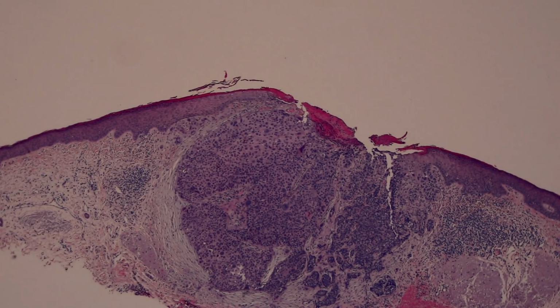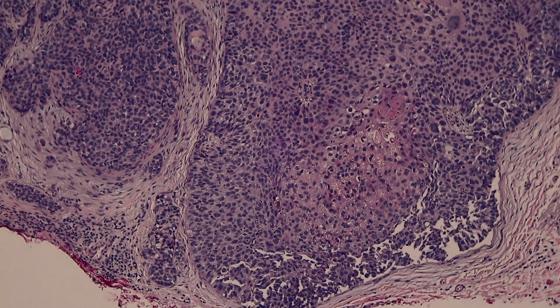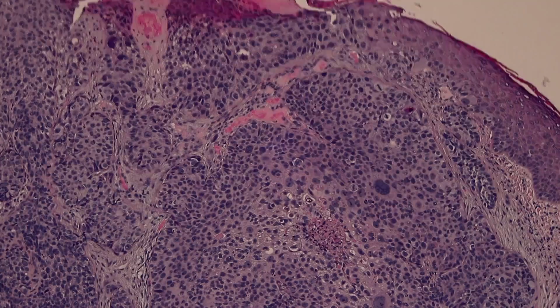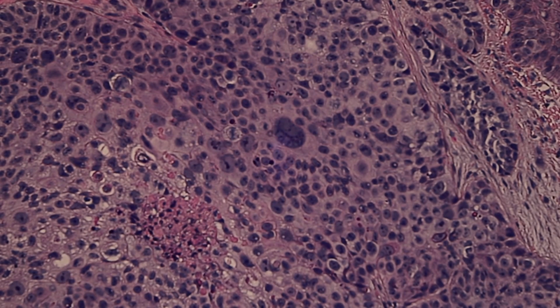Okay, this lesion is a lot more basaloid and blue in appearance, and sometimes these can be a little bit hard to tell apart from a basal cell carcinoma. But I think a couple of features that help me are seeing the keratinization in here. You can see the pink areas of keratin. There's not really any basal palisading or clefting around the outside of the nest. There's marked atypia, which you can have in basal cells. Basal cells can be pleomorphic.